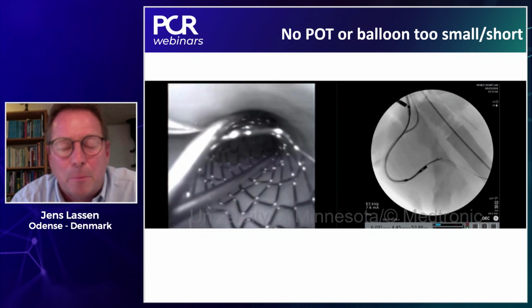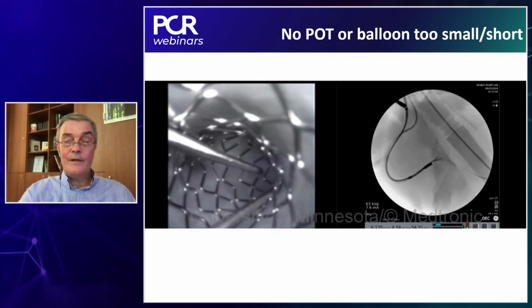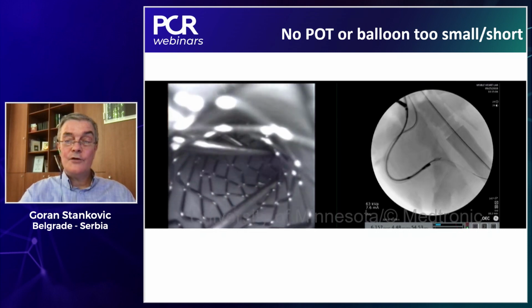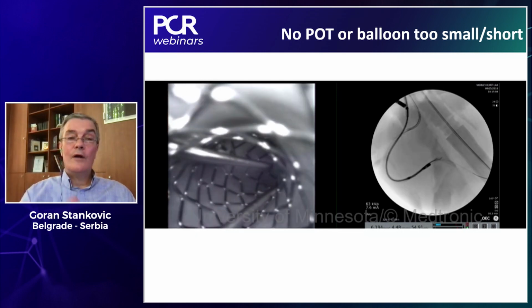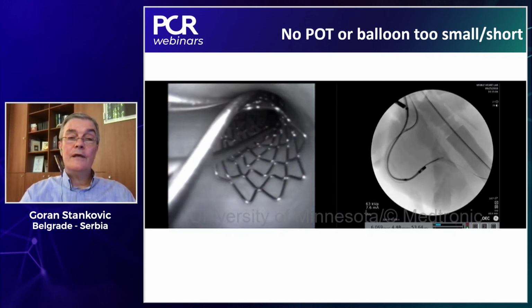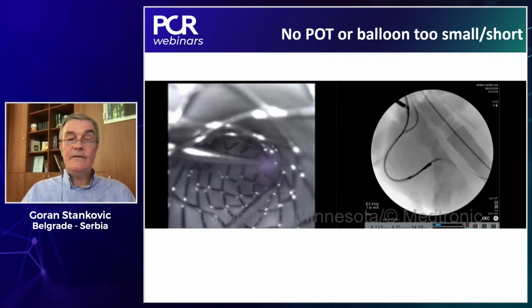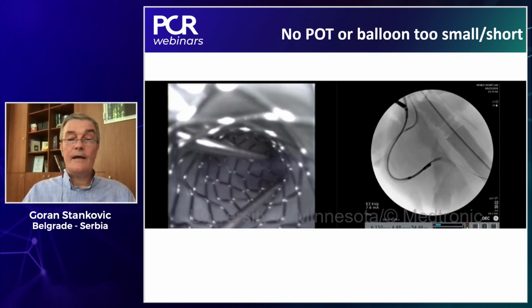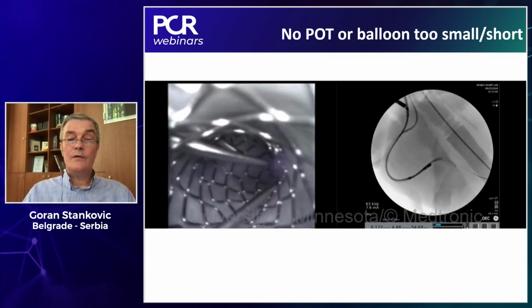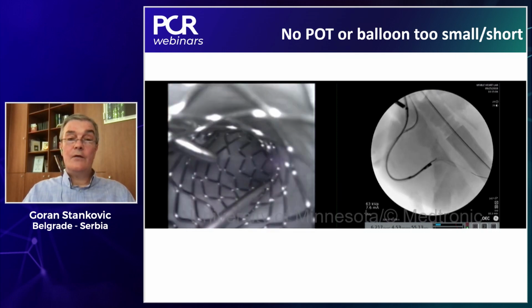And actually, you also have the angiogram, and I would like to point your attention to the angio, in which you don't really appreciate that the wire goes in and out or abluminally completely outside of the stent. So by angiography alone, you are not able to see this, and you need to understand the specificities of the bifurcation anatomy, and first correct the optimization of the stent in the proximal part, and then go to rewiring. Of course, keeping a jail wire inside.